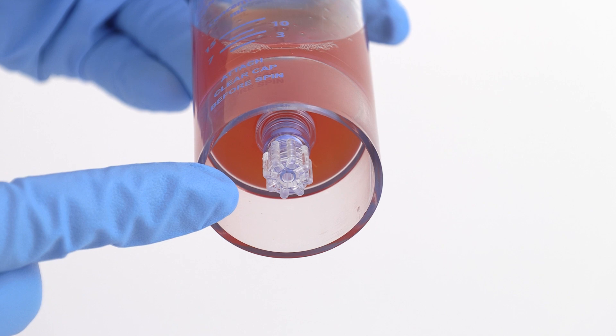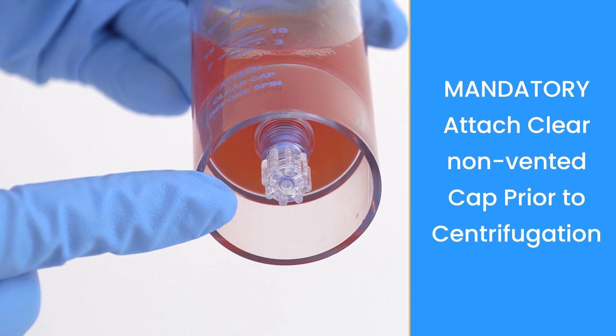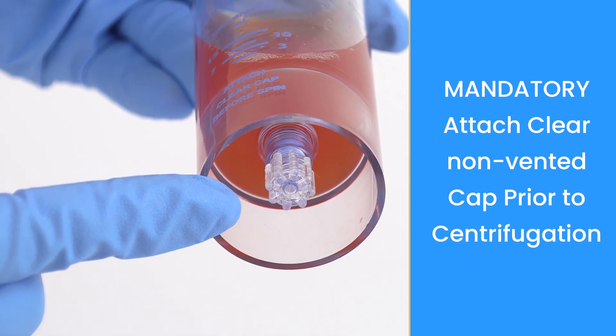When completed, place a sterile clear cap back onto the bottom port of the concentrator device.